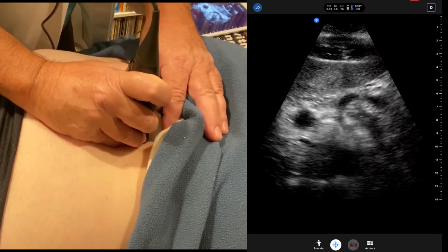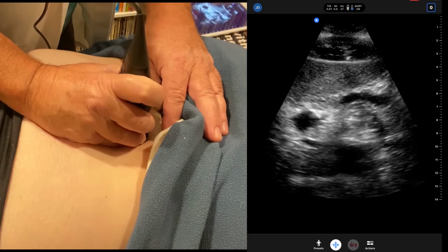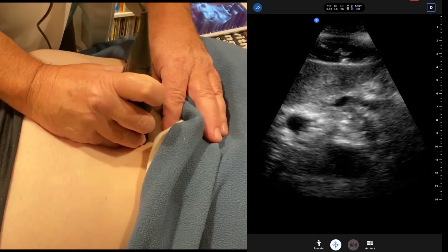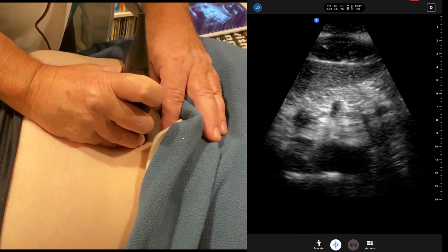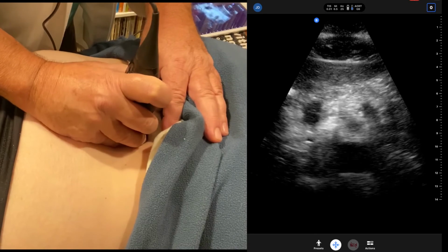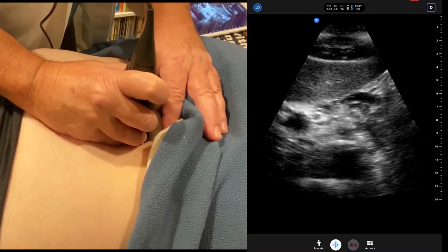And we see the nice image here. The splenic artery, and then to the left, the hepatic artery. This is known as the seagull sign. And we can see it here as we scan and fan through it a lot more than our last patient. And there's the seagull sign. See it up to the right.